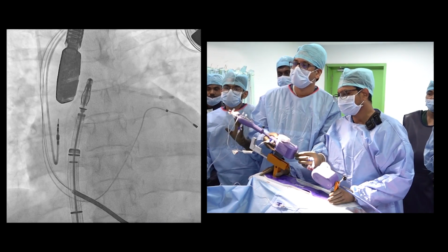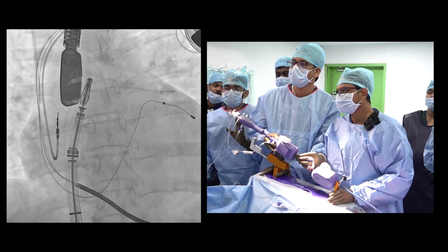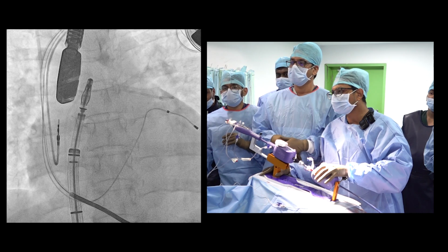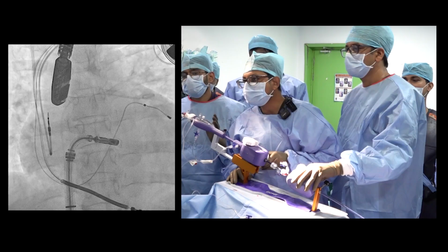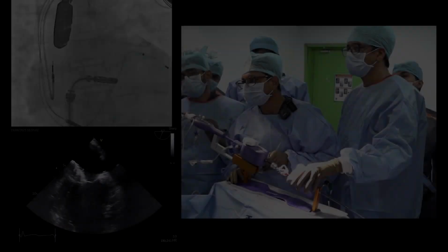Yes. You are in upper pulmonary. Near to upper pulmonary, because you are too much in. Can you go a little anterior, sir? Now go ahead, sir. Go ahead. I am continuing M. Okay, okay, okay. Go fully posterior, sir.